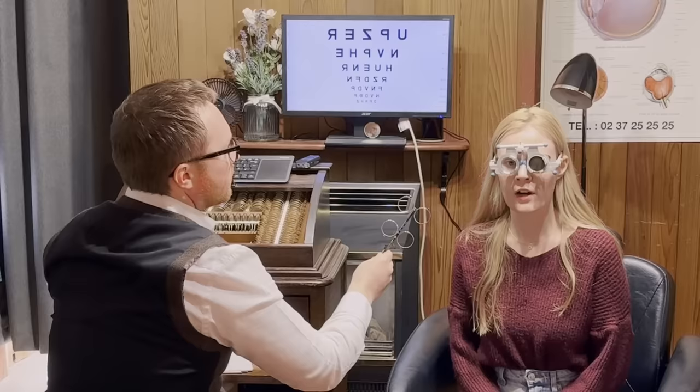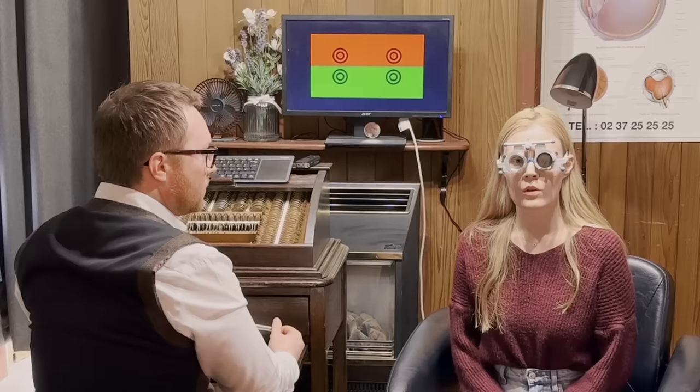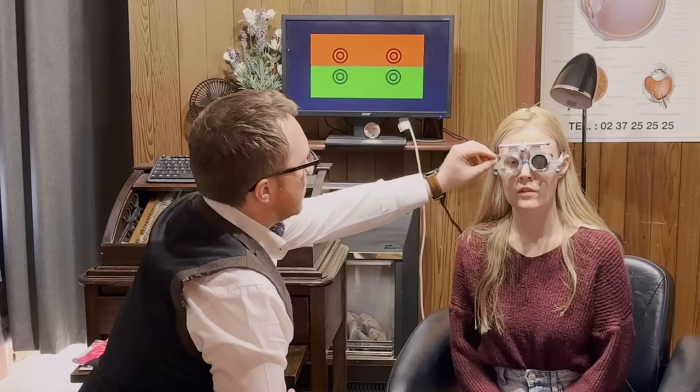And if we have a look at the circles on the red and the green now, are they looking rounder and clearer on the red, the green, or are they about the same? The red. Just out of interest, if I were to pop this lens in front, has that made them a bit more equal? Is it a bit more red, a bit more green? More equal. Okay. Did you want to read that bottom line for me?